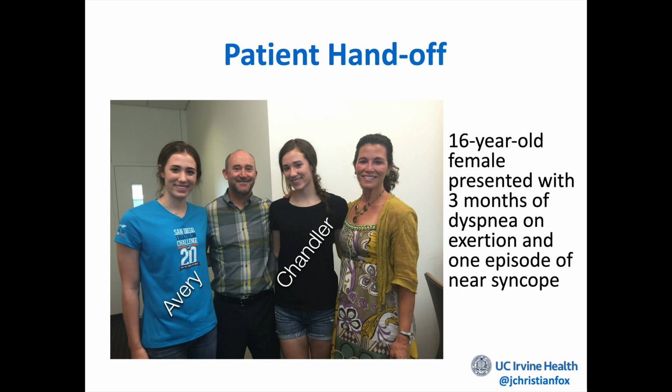So I went in the room to talk to the family. Chest X-ray, of course, was not useful. I went in the room to talk to them. I brought the ultrasound machine there. I was gonna use the machine to look at the IVC and then give her a lecture on being dehydrated. I don't know why that was going through my head. I'm just going to show her she's got a flat IVC, and then she's dehydrated.